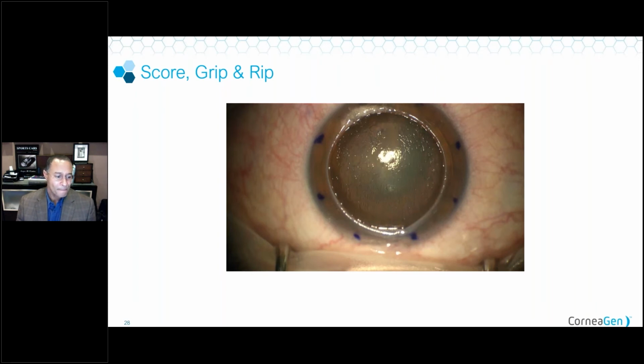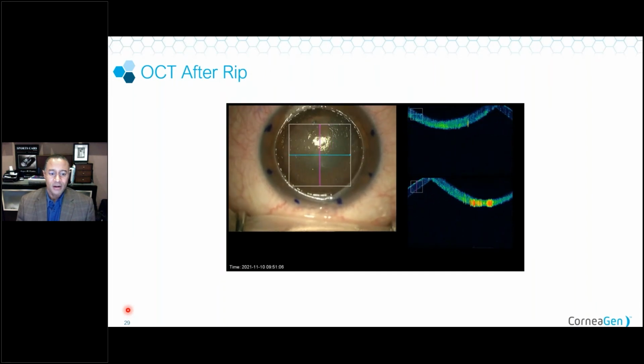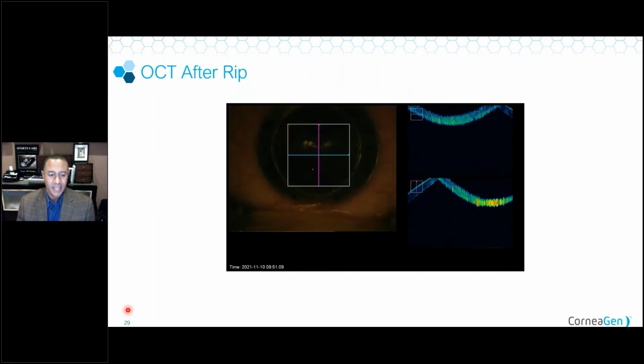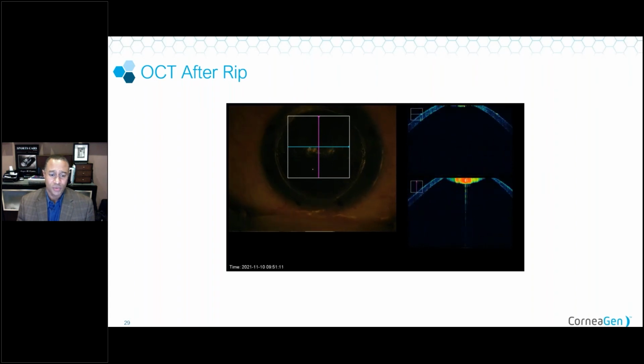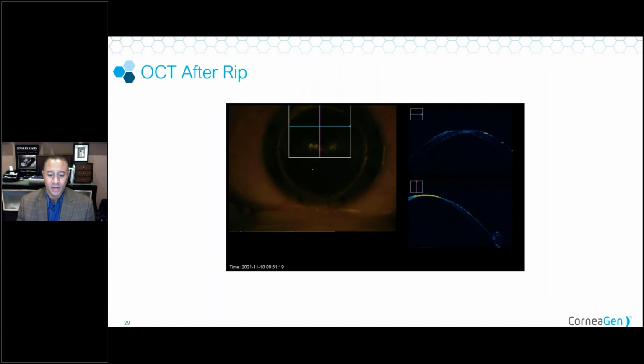Next slide. So here is that bed. And again, no reason to rush in this situation, right? We can take our time. Cornea is nice and stable, patient's comfortable. We just use block anesthesia.